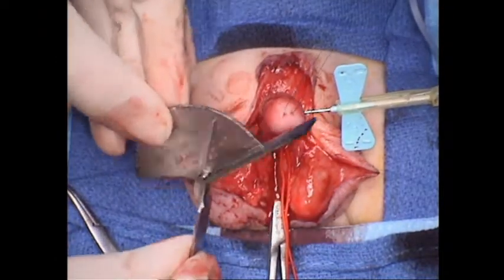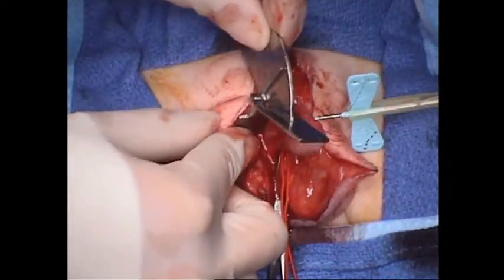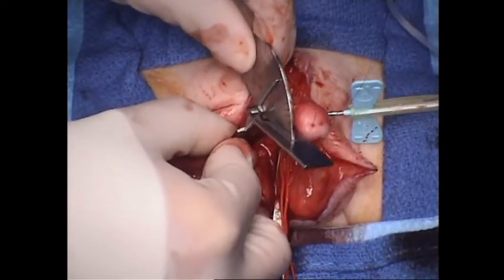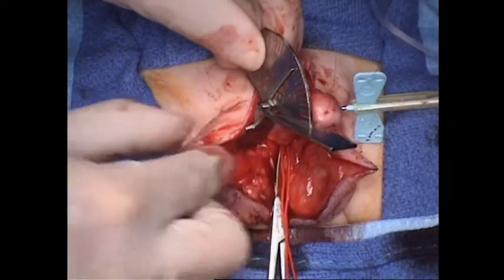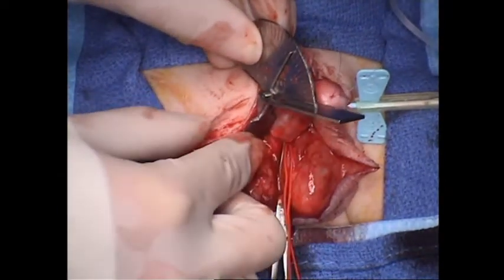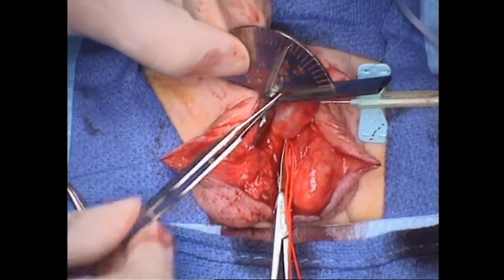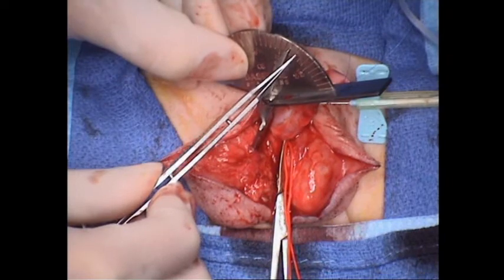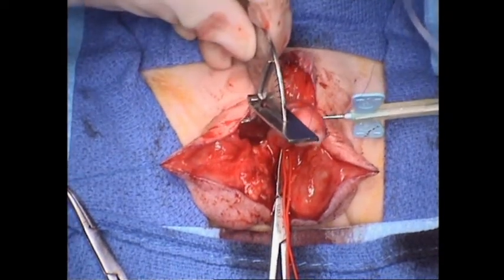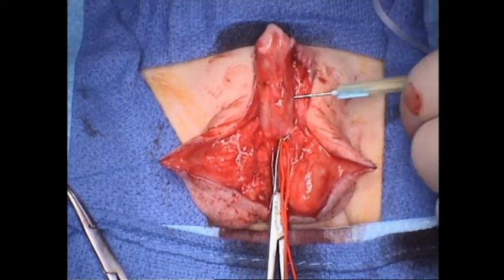Now, this is a goniometer, and it is an orthopedic joint measuring device that does an excellent job at measuring the degree of curvature. So for this patient, we're measuring along the corpora and along the glans, and we see that his degree of curvature, here's 30, 35, 40, 45, 50. So he's about 53 degrees curved. That's too much for a plication to work.